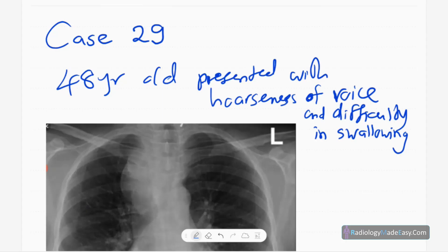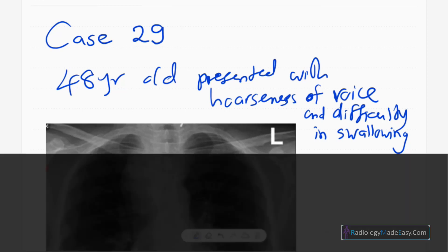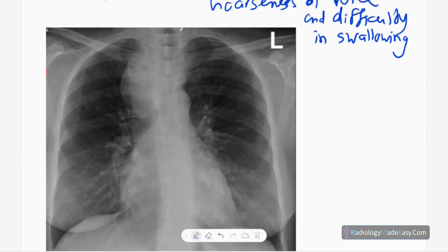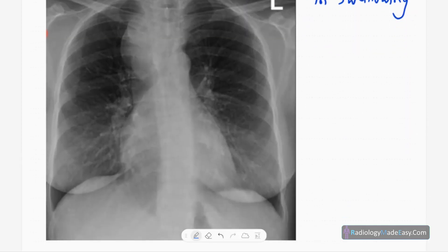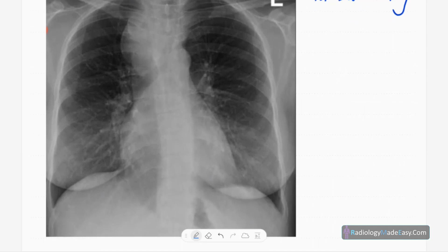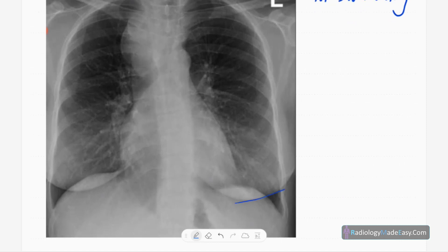This is case number 29 in the RS series in radiology. Today our patient is a 48-year-old patient who presented with hoarseness of voice and difficulty in swallowing. This is the frontal chest radiograph of a middle-aged female patient.